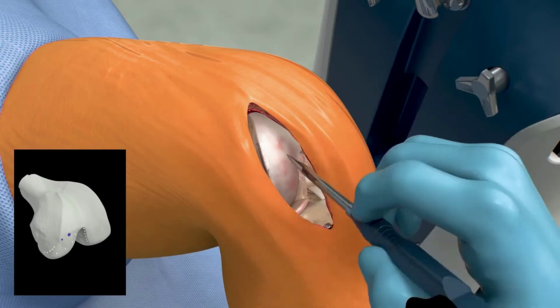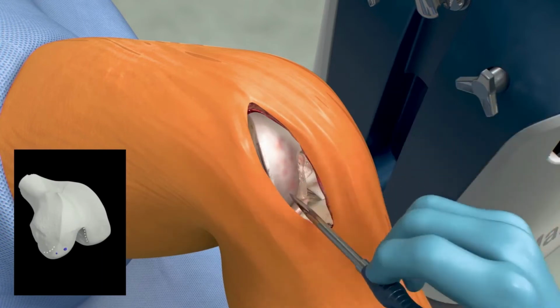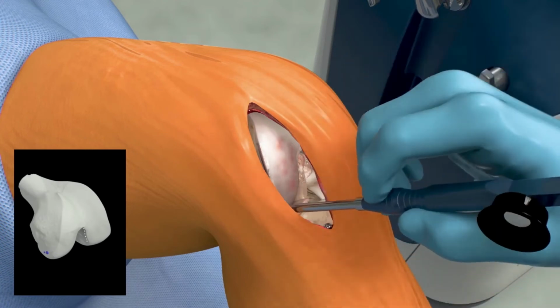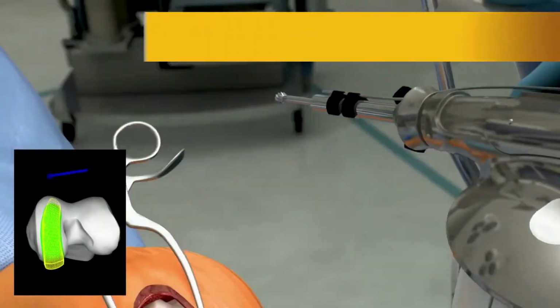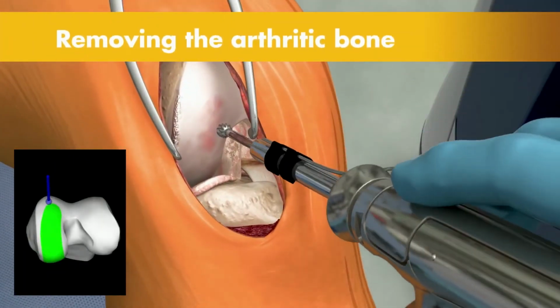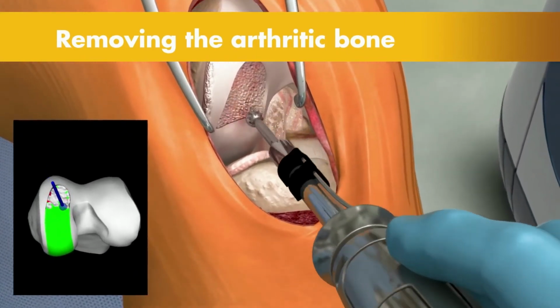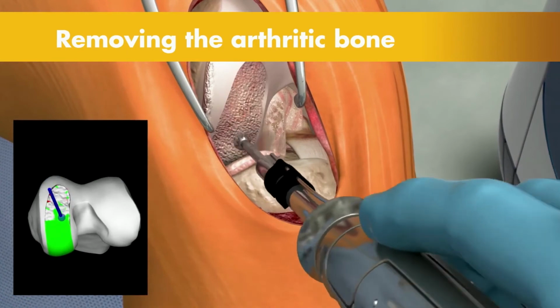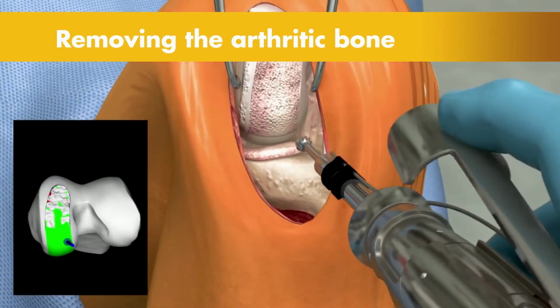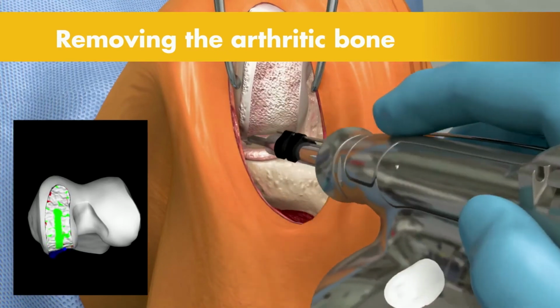Once the anatomy is registered to the 3D model, the surgeon has the flexibility to modify the preoperative plan based on their assessment of the patient's anatomy and range of motion. Then the surgeon guides the robotic arm to remove the arthritic bone and cartilage from the knee. A virtual boundary provides tactile resistance to prevent the surgeon from removing more than just the arthritic bone identified in the preoperative plan. And visual cues, shown in green, appear on screen to show how much bone to remove.